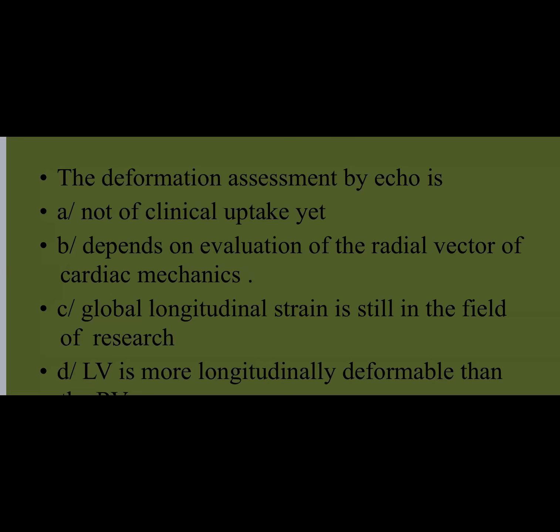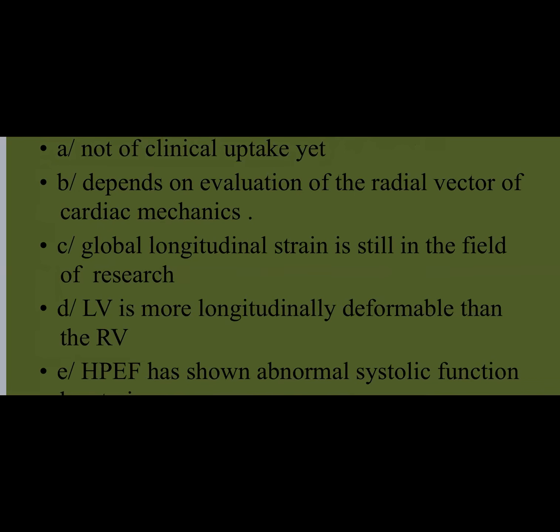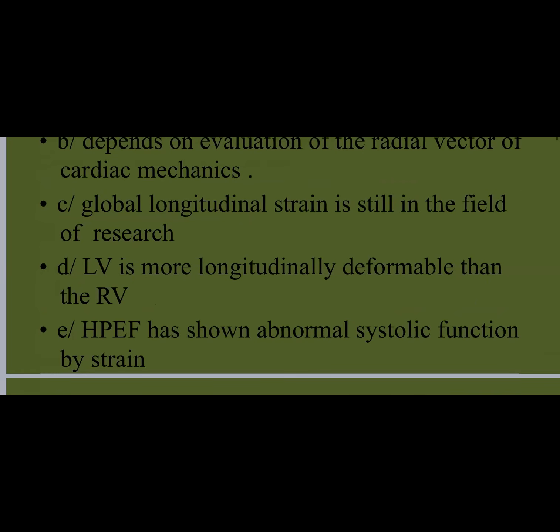Depends on the evaluation of radial vector of cardiac mechanics, and we have explained what radial contractility means last time. I'm admitting some other people. Global longitudinal strain is still in the field of research. LV is more longitudinally deformable than the RV. HFpEF has shown abnormal systolic function by strain.